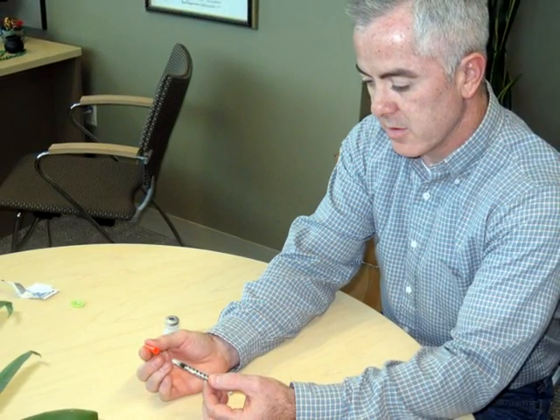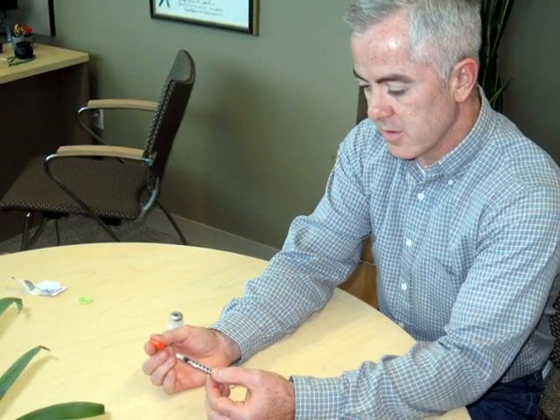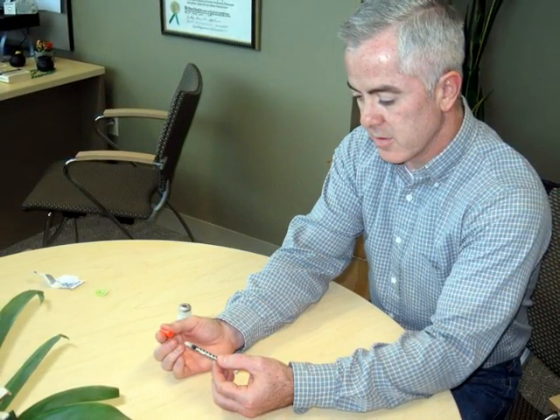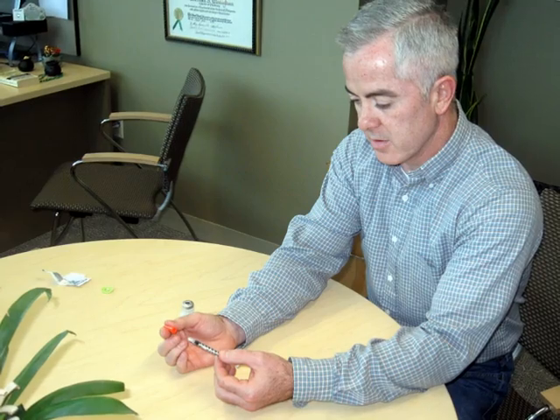That's it. Now you can feel confident in your ability to self-administer insulin. Follow your pharmacist's instructions regarding the appropriate disposition of the used needle.